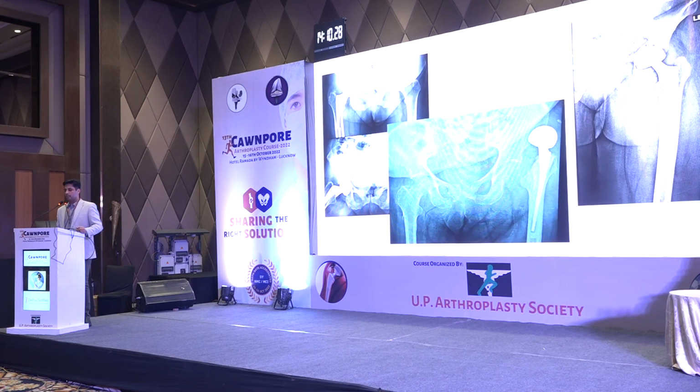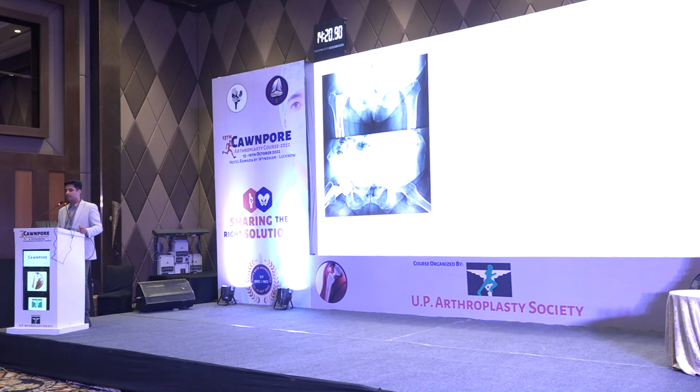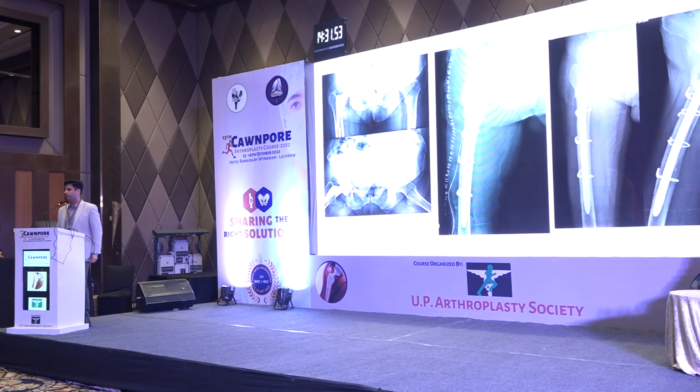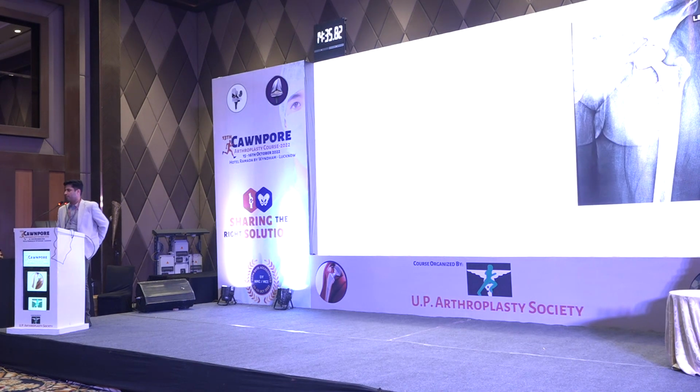So that's the case. We've seen the 3 different cases that I showed you in the beginning, and I said, look, it's not the same. They're not the same as the early case. Let's see how we tackle each of these. The first one, as you can clearly make out, you just can't simply go from the top. So here we did a classical extended trochanteric osteotomy, removed the stem, and then put in a long revision stem with cerclage wires, which of course went into healing. A few brave ones would probably attempt to do something else.